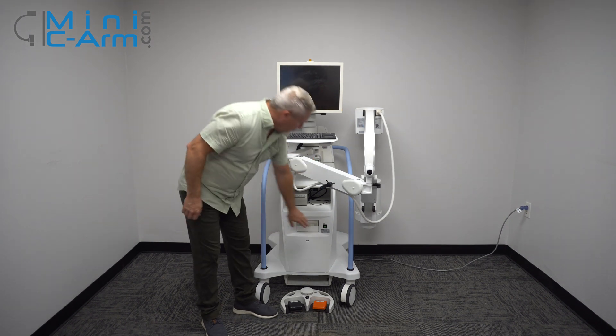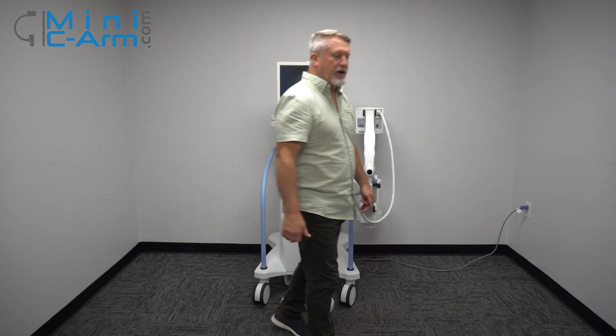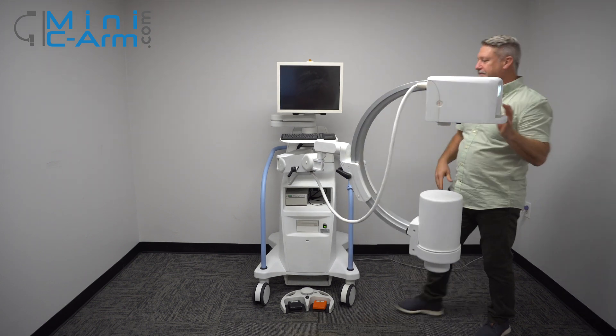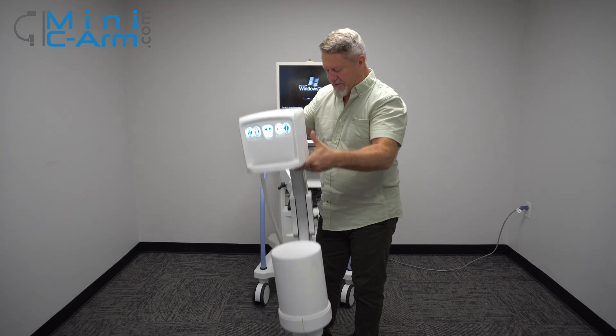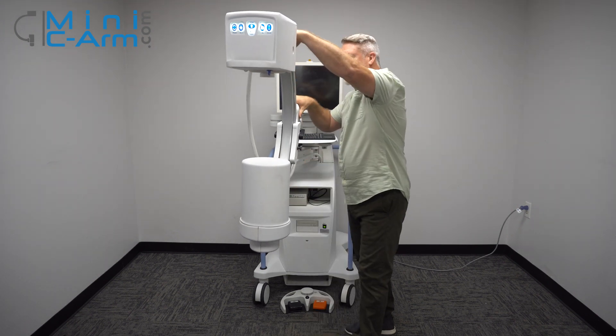First, we'll turn it on with the green button down here — that's the power button. While it boots up, we'll take a look at the C-arm's articulation. It goes about as low as knee height and up to approximately belly button level.